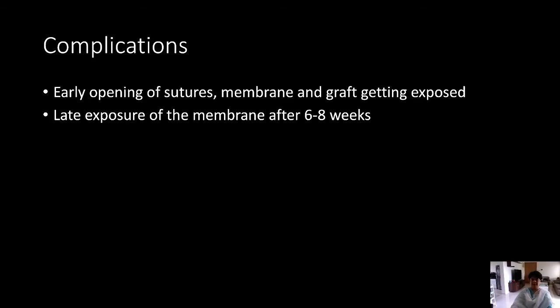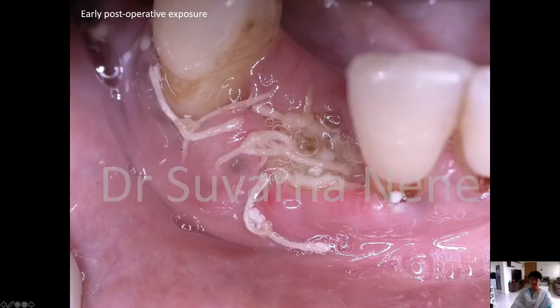Early opening of sutures is one of the complications where the membrane and graft get exposed, and the second possible complication is a late exposure of the membrane. So in this early exposure of the membrane, as you can see, I've not even removed the sutures and I can see the membrane, I can also see the graft.